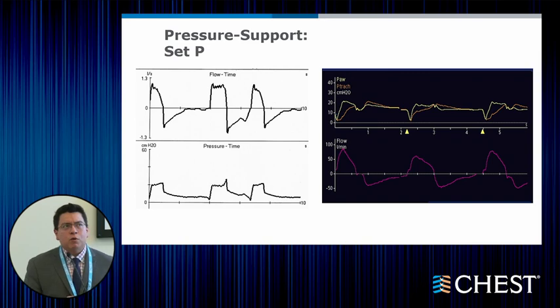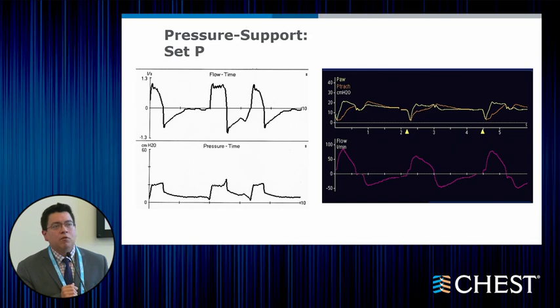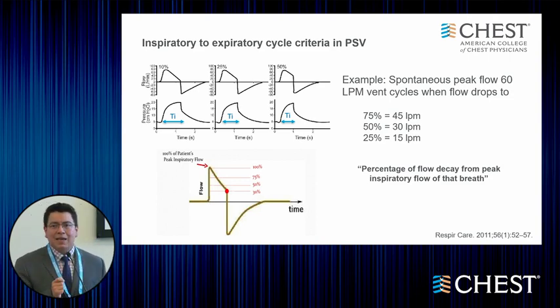In pressure support ventilation, we set the PEEP of the patient, and we set the pressure support that we want to allocate for this particular patient depending on their effort, the weight of the patient, the position of the patient, etc., to maintain a decent amount of minute ventilation. What is particular about this mode, as we discussed earlier, is the cycling mechanism.